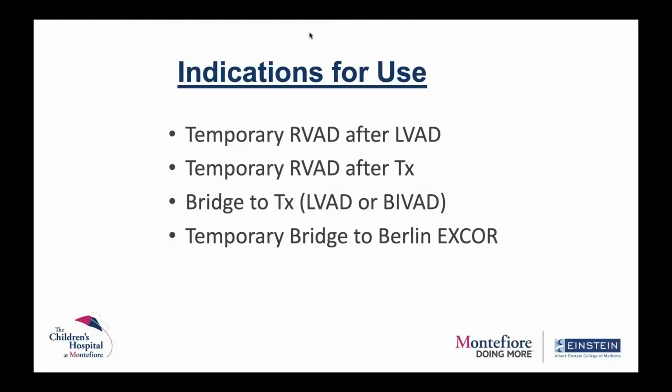Sometimes you can bridge patients to transplant using just Centromags as just an LVAD or BiVADs. And if you are doing something urgently or emergently, and want to wait to give a long-term VAD to these patients later, this can be used in pediatric patients as a bridge to Berlin Heart or even HeartMate 3s.